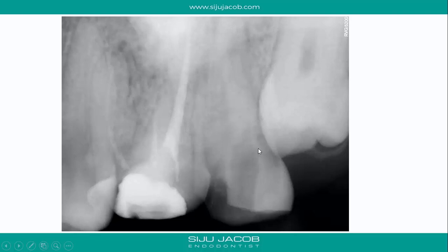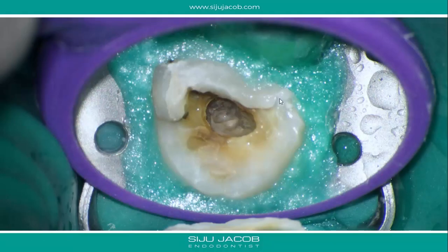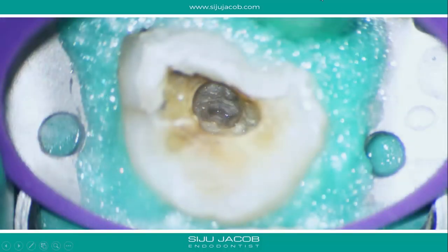It wasn't very clear because there didn't seem to be any canal visible in this tooth. So we decided to isolate the tooth to see what had happened so far. When I isolated it I found quite a bit of food impaction inside the cavity — there was an existing access cavity with food stuck in it. When we removed the food there was quite a bit of soft decay, so we cleaned all that up and then had a good look at the tooth.